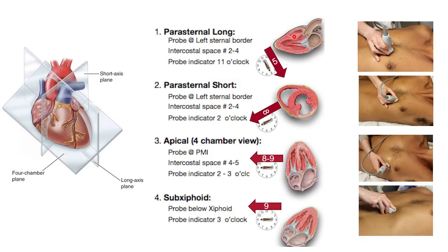To do that, it doesn't matter what mode you're in, abdominal or cardiac. If you're in abdominal mode and the indicator is on the left side of the screen, the indicator will go here at the 5 o'clock position. If you're in cardiac mode and the indicator is on the right side of the screen, we still need to get the apex on the left. So we do a 180-degree turn and the indicator is in the 11 o'clock position.